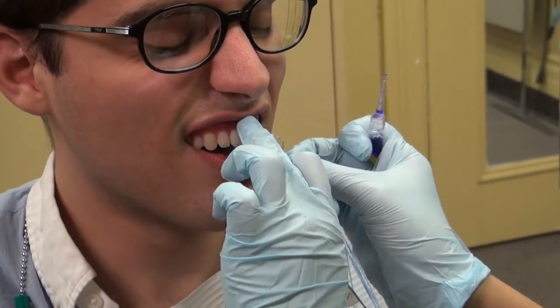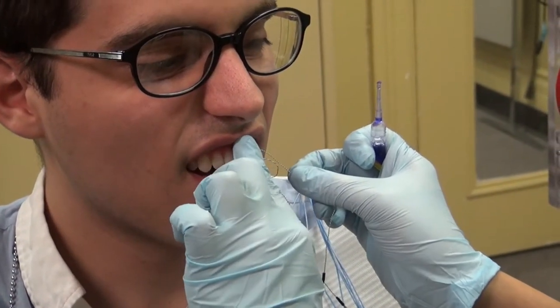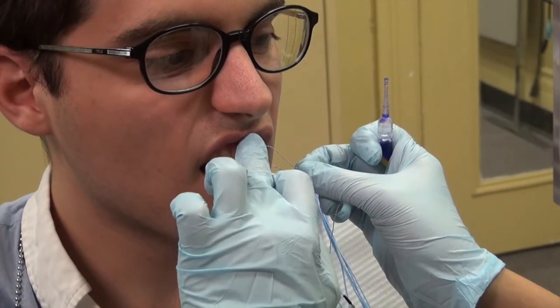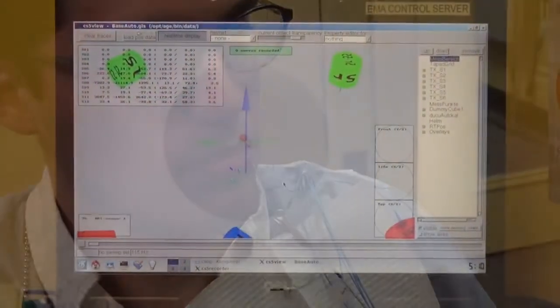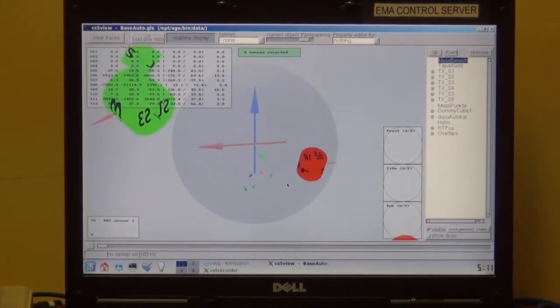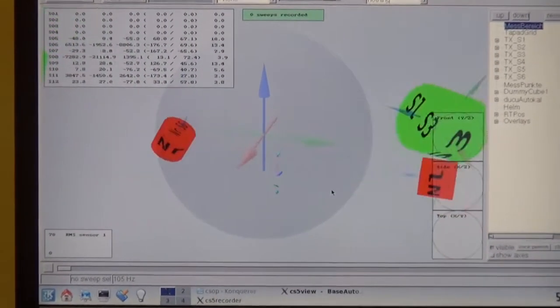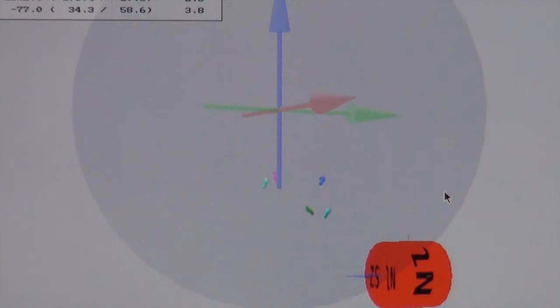The coil's distance from the electromagnetic transmitter, as well as their orientation in relation to the transmitter, is sampled in real time. A computer program measures the changes in the coil's positions, graphs the data, and produces a three-dimensional animated model of the movements of the sensors.